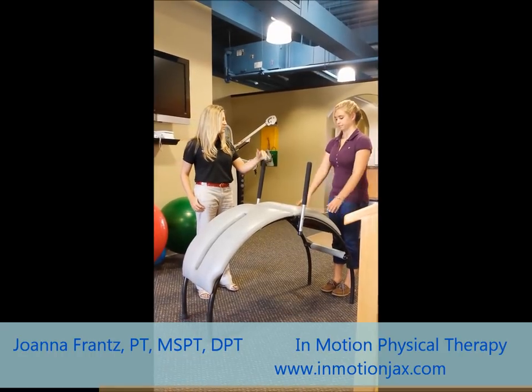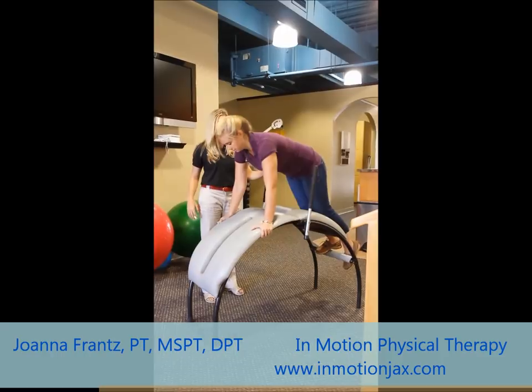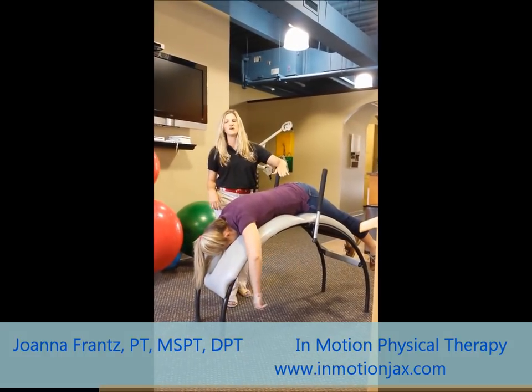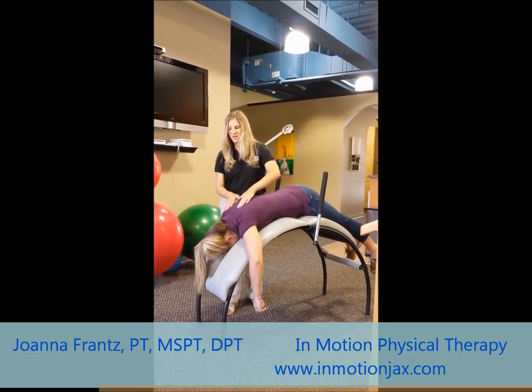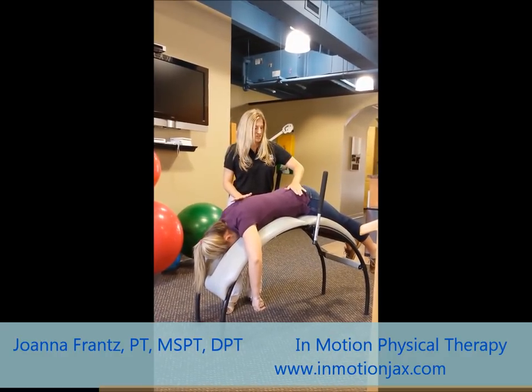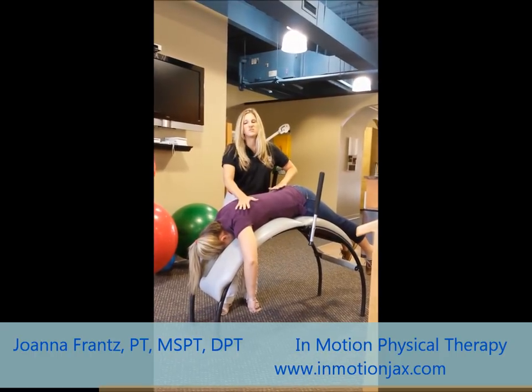First, we're going to show face down. Stepping up on the step and coming forward, she'll lay straight down and can rest her head through there. This is going to really help stretch the lower back, the mid-back, and up into the neck. While she's here, I can do some nice, gentle stretching to help open up some of those tight muscles.